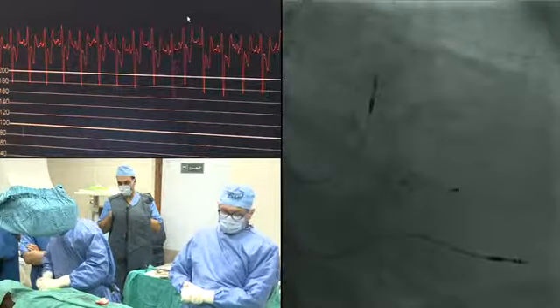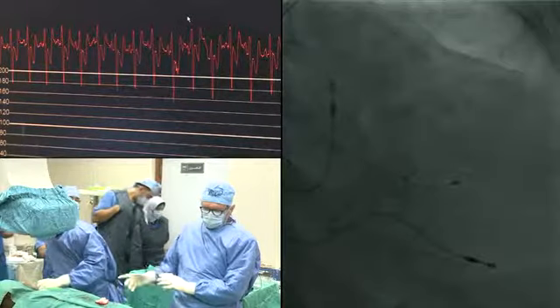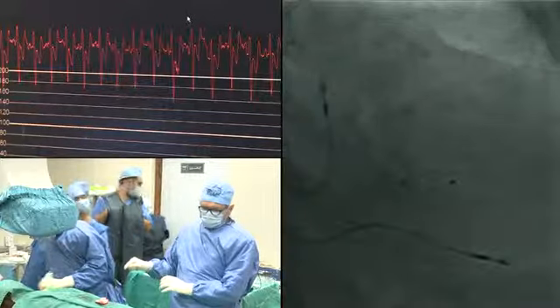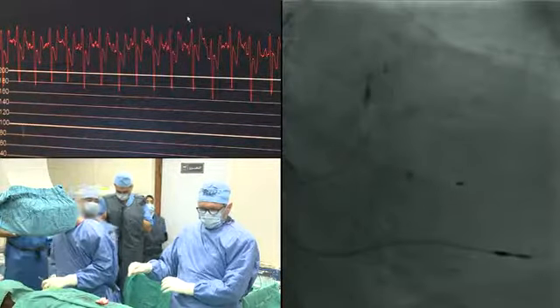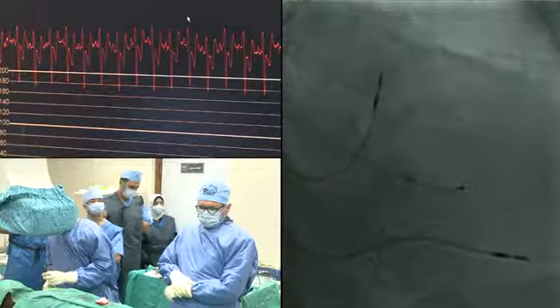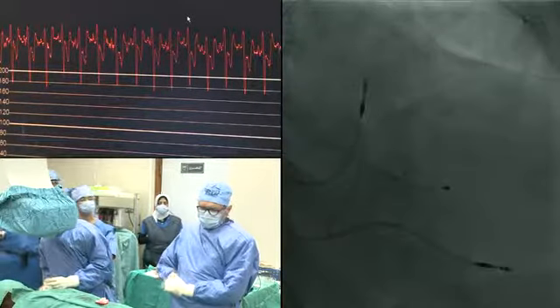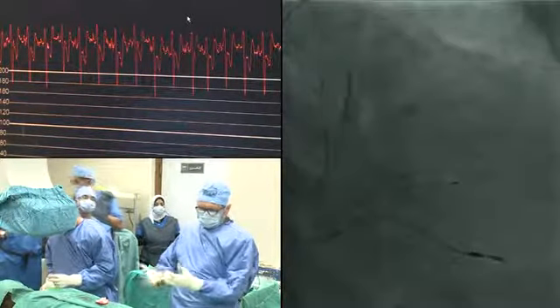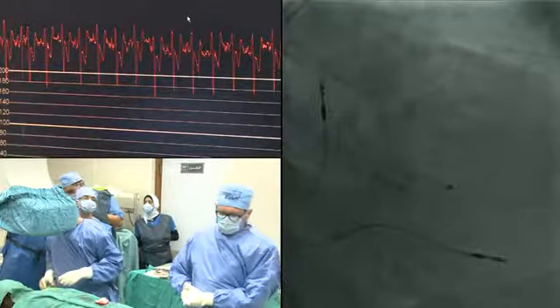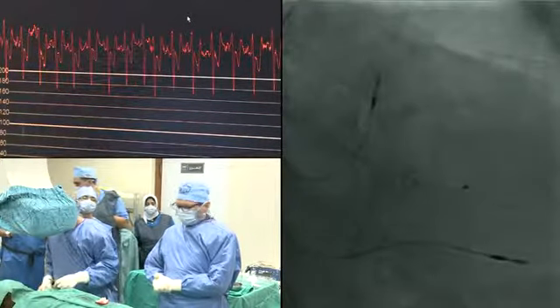Me personally, Dr. Ali used a subclavian vein approach here. I tend to use fluoroscopic guidance for an axillary vein approach, just as a sort of lesser likelihood of pneumothorax since it's extrathoracic. But I don't find cephalic vein cut down particularly useful. But again, it's an operator preference and training.